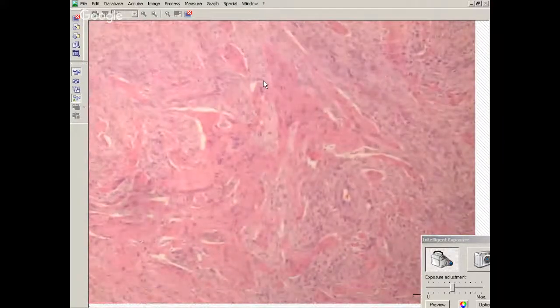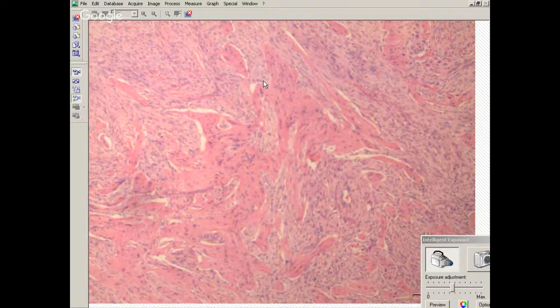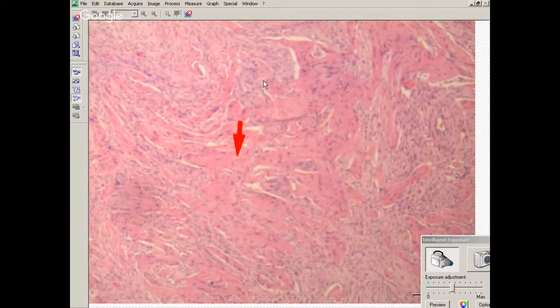Typically with a gliosarcoma, it's a biphasic tumor. Biphasic meaning that you have two histologic populations of tumor cells. One population is more densely cellular, another is less densely cellular, more differentiated. One population is reticulin-rich, and the second population is GFAP positive. So you get a reticulin stain and a GFAP stain, and it shows the two different populations. You're dealing with a gliosarcoma. Most gliomas don't have a dense reticulin network, but in gliosarcomas, you do.